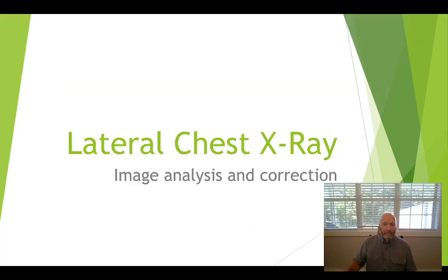Talk about today's lateral chest X-ray. I did a video Wednesday on PA and AP chest. So we're going to do lateral chest X-ray today. We're going to not just talk about positioning, but we're going to look at some images. We're also going to look at image analysis and correction.